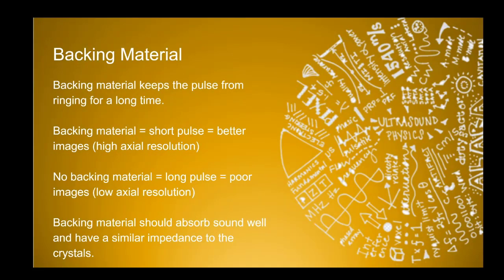So our backing material should be able to absorb sound well, and it's actually going to have a similar impedance to the crystals. So when they are activated, the sound is going to be more likely to transfer into the backing material versus being reflected from the backing material.